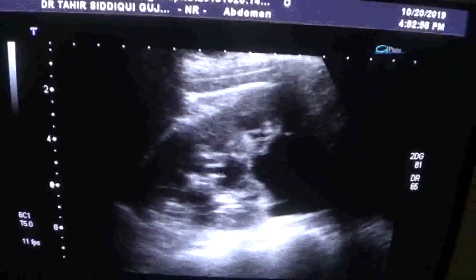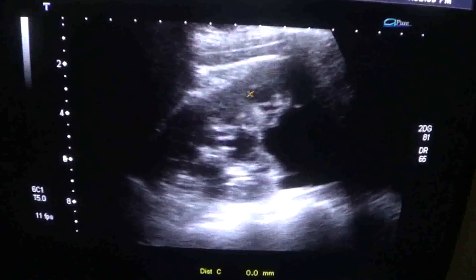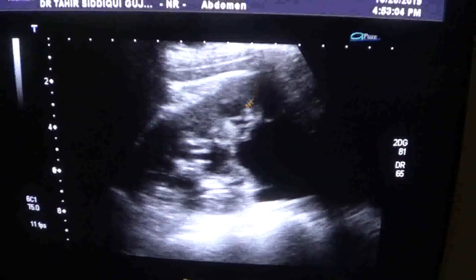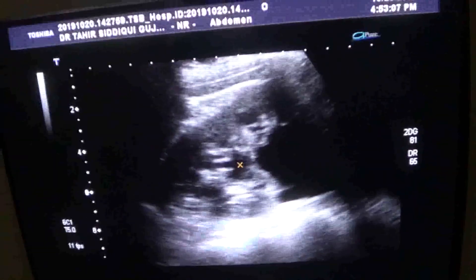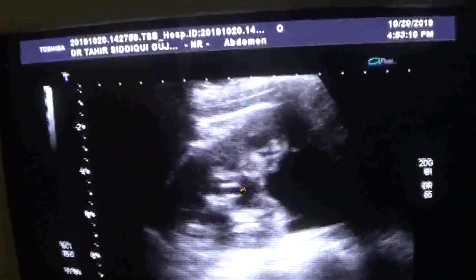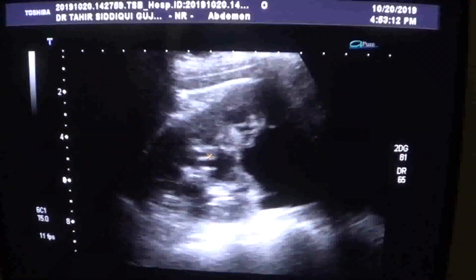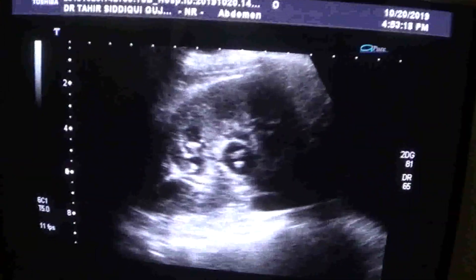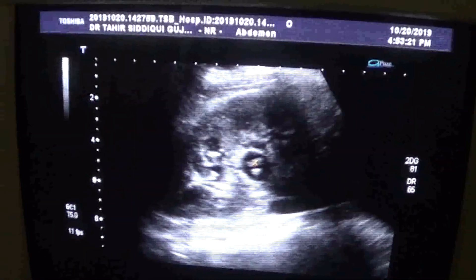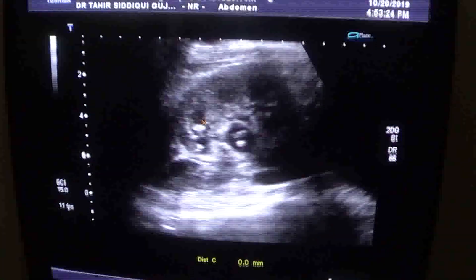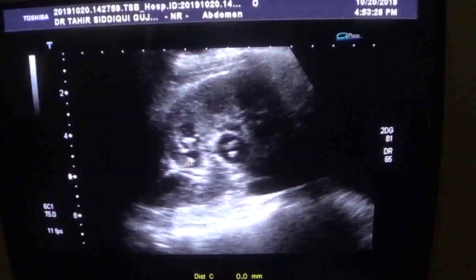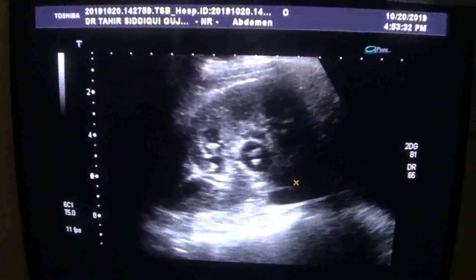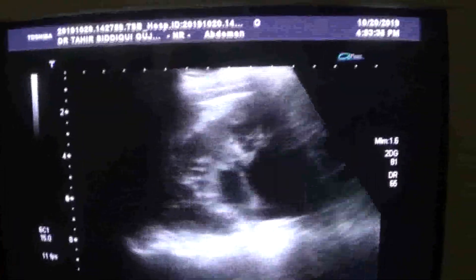This is the cortex, these are the pyramids, so corticomedullary differentiation is intact for almost half of the kidney. There is minimal dilation of the calyces and there are a few tiny concretions seen within the dilated calyces. This is a concretion, this is a concretion, this is a concretion. We also see a small amount of debris — low-level internal echoes within it.